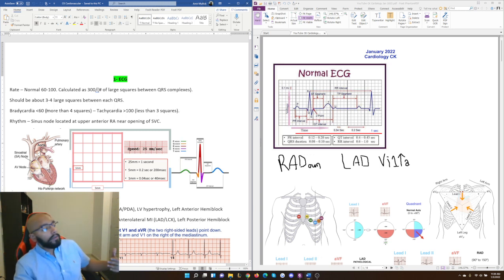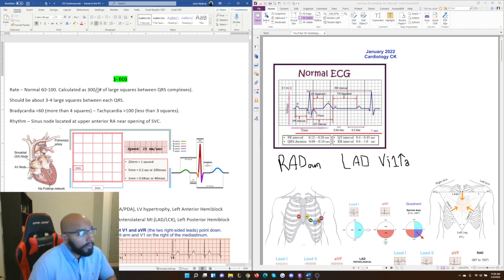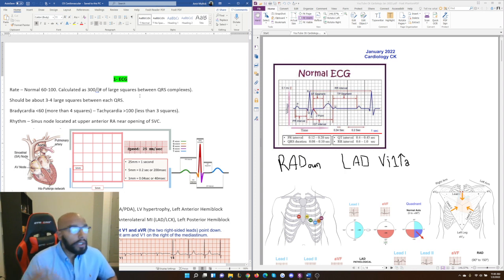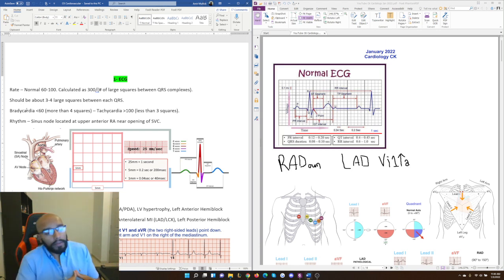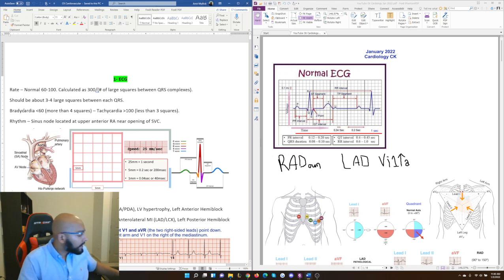Bradycardia is a slow heart rate — less than 60 beats per minute — which means more than four large squares between complexes. Dividing 300 by a number bigger than four gives you something less than 60. Tachycardia is over 100, meaning less than three large squares — 300 divided by two gives 150. With bradycardia, the heart fills with blood and beats slowly, but if the rate is too low the patient can become hypotensive and syncopal, especially with exertion. The heart rate needs to go up when activity demands it.